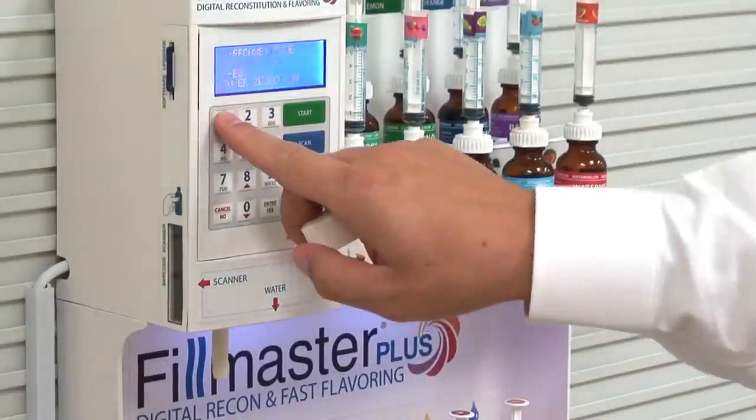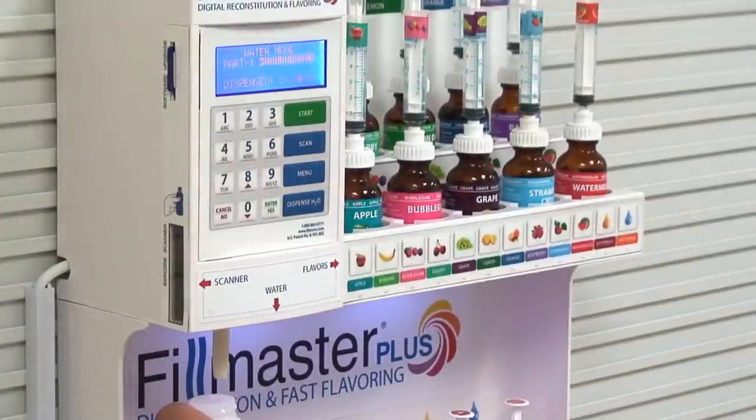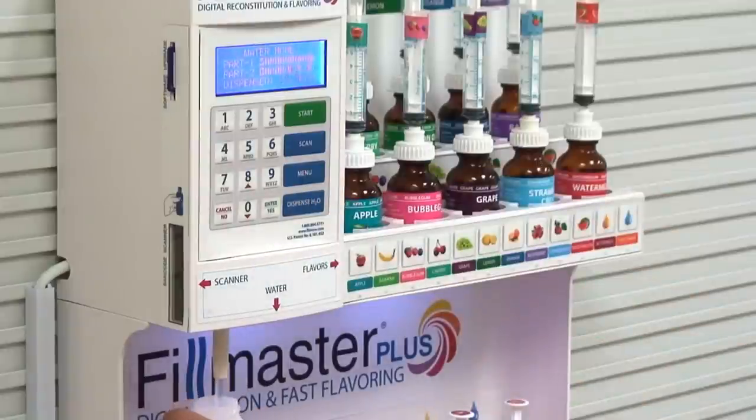Press 1 to reconstitute only. Press dispense to dispense the first half of the water required. Pause halfway for mixing. The machine will warn you if you do not dispense the second half of the water required. Press dispense again to complete the process.